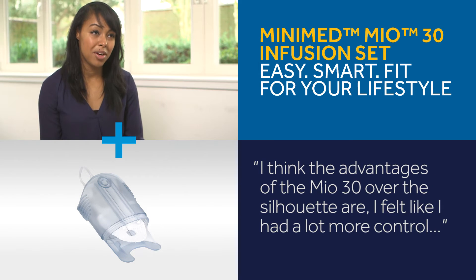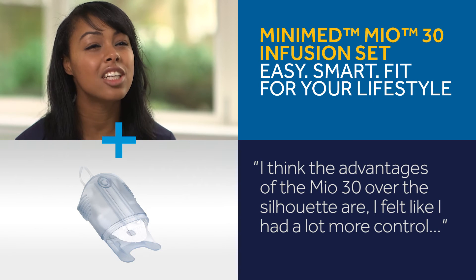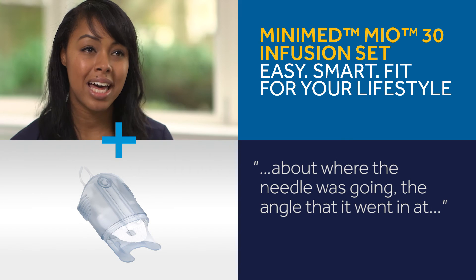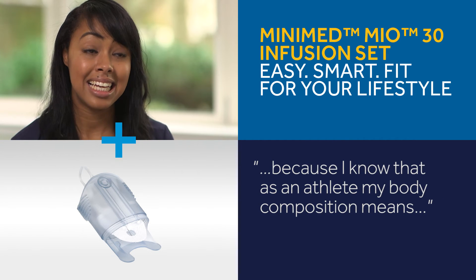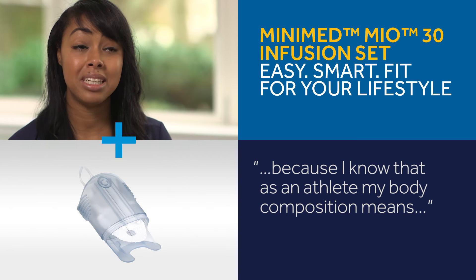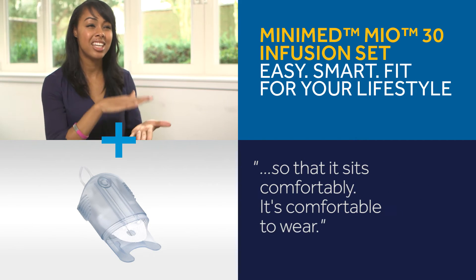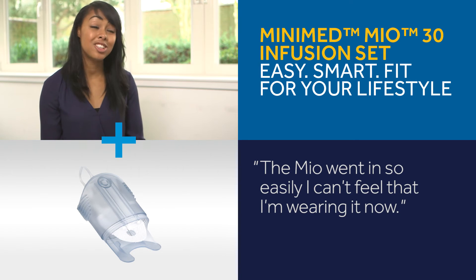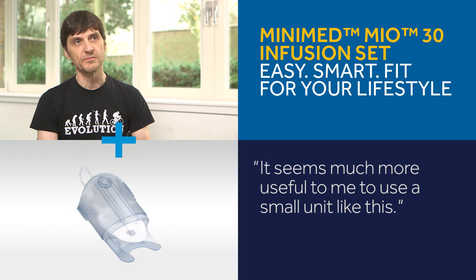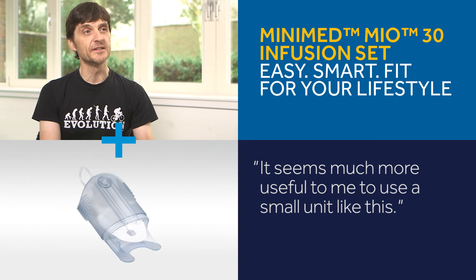I think the advantages of the Mio 30 over the Silhouette are that I felt like I had a lot more control about where the needle was going and the angle that it went in at. As an athlete, my body composition means I need to get the needle into the correct area so that it sits comfortably. The Mio went in so easily — I can't feel that I'm wearing it now. It seems much more useful to use a small unit like this.